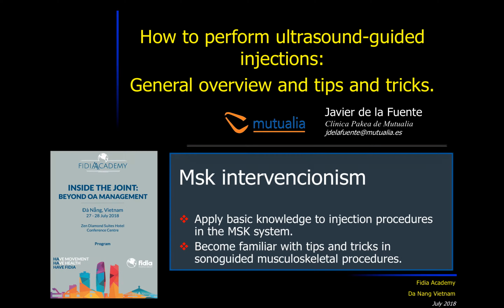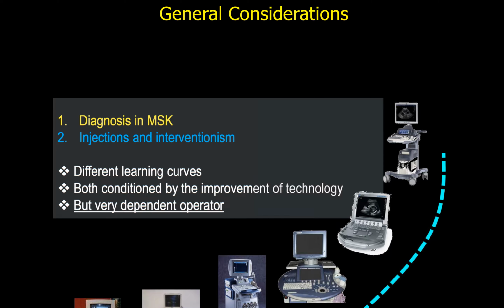So now I want to speak about how to perform ultrasound guided injections, especially applying the knowledge to know how to make the injection procedures in the musculoskeletal system, and also to become familiar with tips and tricks in this type of procedures. As we know, diagnosis and injections and interventionism have different learning curves, but both are very dependent on the operator.